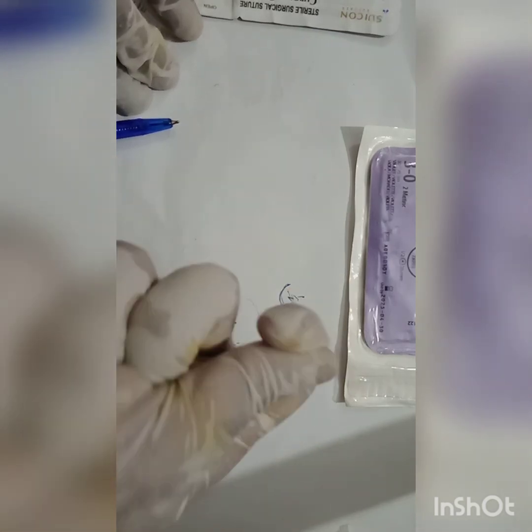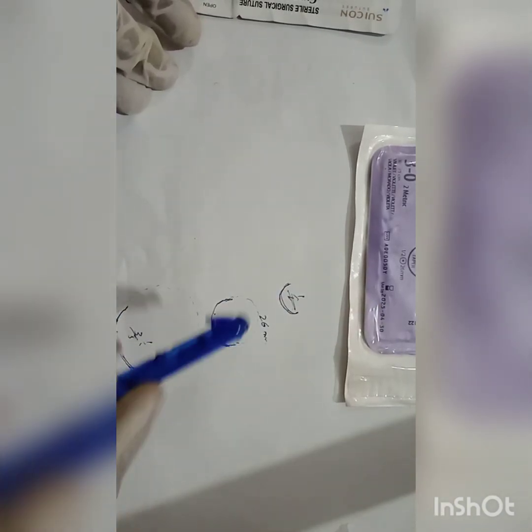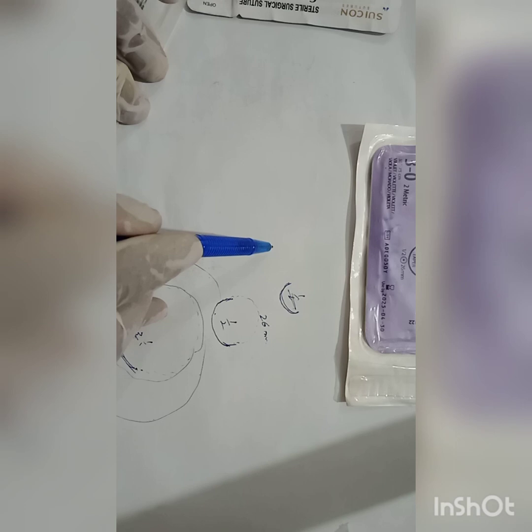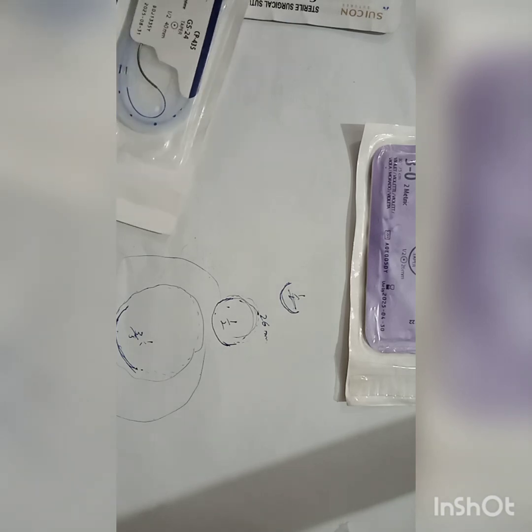So you know that while working in the surgical field, we supinate and pronate, rotate the needle, not drag it in a straight way. We supinate and pronate, meaning we are making a circle. So the bigger the circle means you need a bigger surgical area, but if you are working deep or in a small surgical field, you may need a small needle to work properly. That is one reason to know about the circle of the needle.